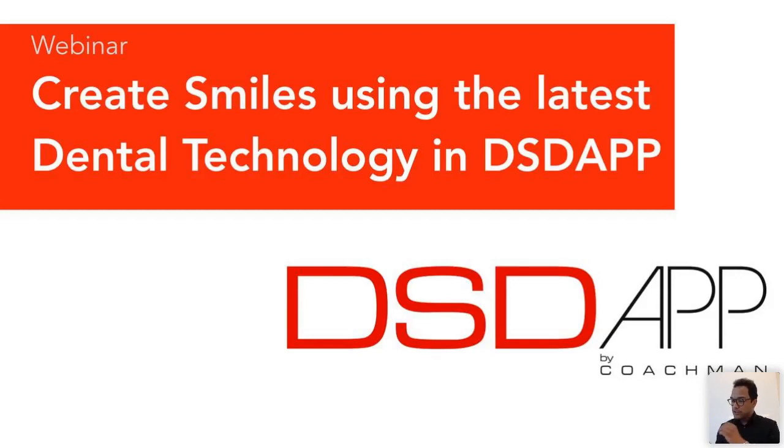And I promise you that within these 20 minutes, I will show you how technology will help you create these facially driven smiles using DSDApp. And at the end of this webinar, you will also be able to start your free trial to deliver amazing smiles to your patients.